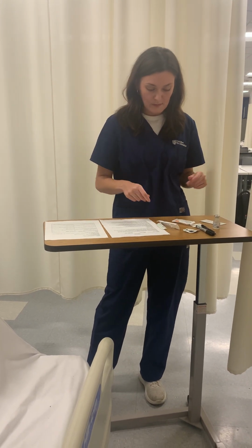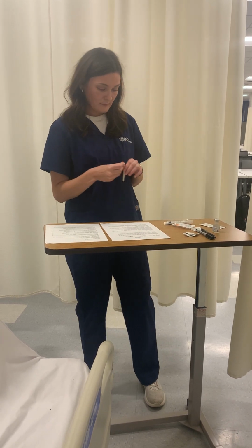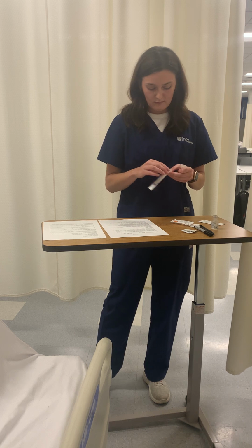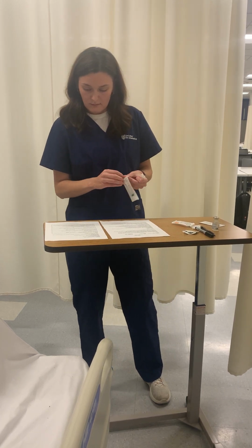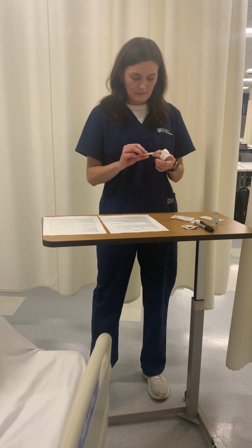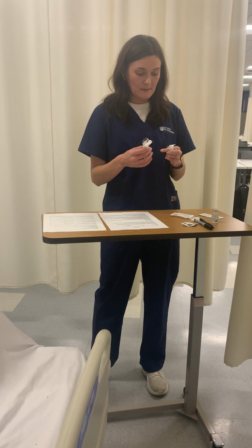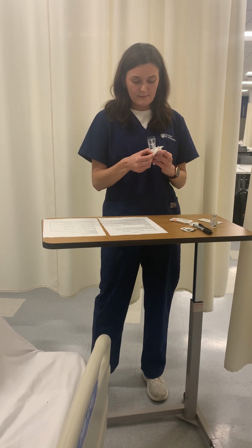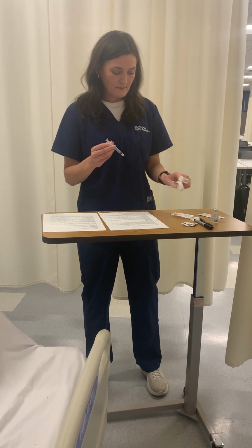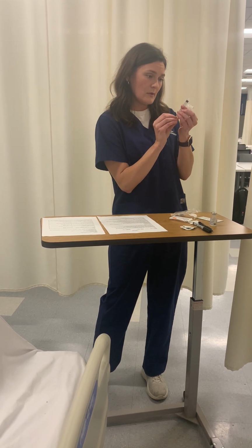Okay, so while we do that, we're going to do the blunt tip needle. 0.5 mL. Maintain sterility here. I'm going to draw 0.5 mL of air.